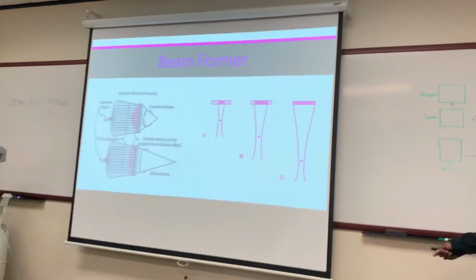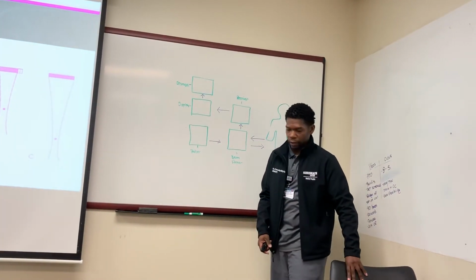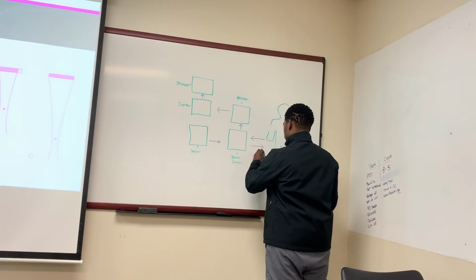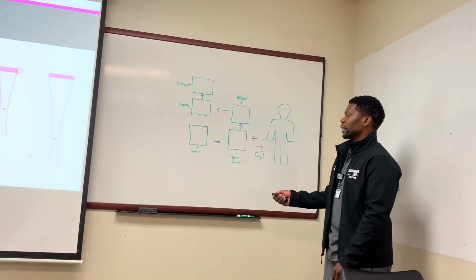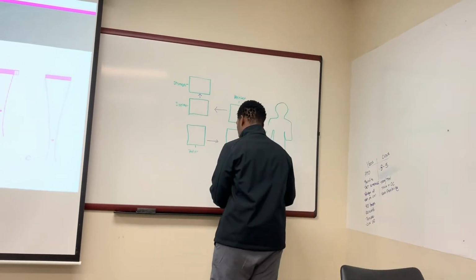Okay, guys. So I want to redraw our diagram again because I want to add to it today. All right. So we're going to start off. Actually, I need to add one more thing right here. Add our transducer. Okay. That's our transducer right there. So we got our pulser. That's going to control our electrical signals, our amplitude, our strength.